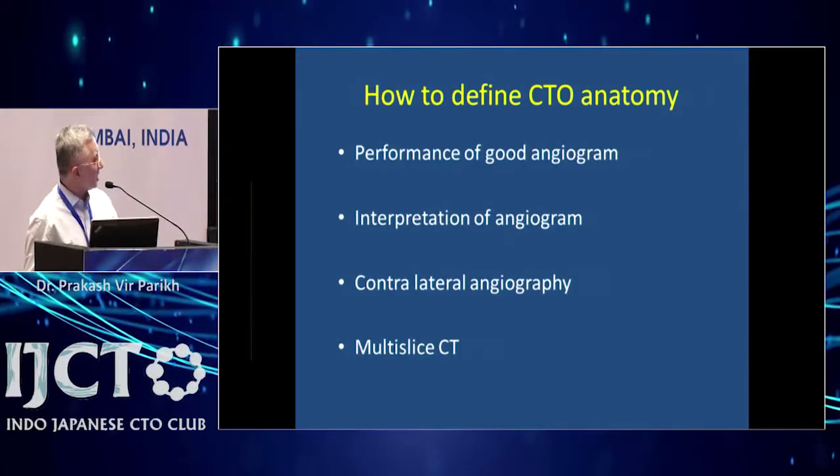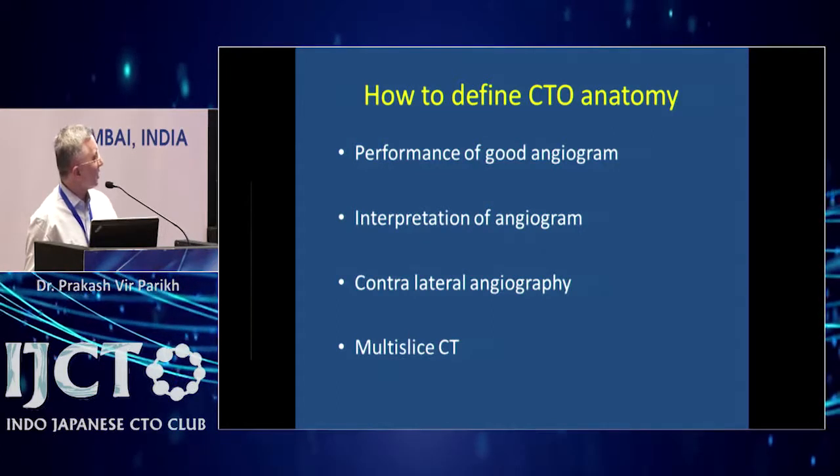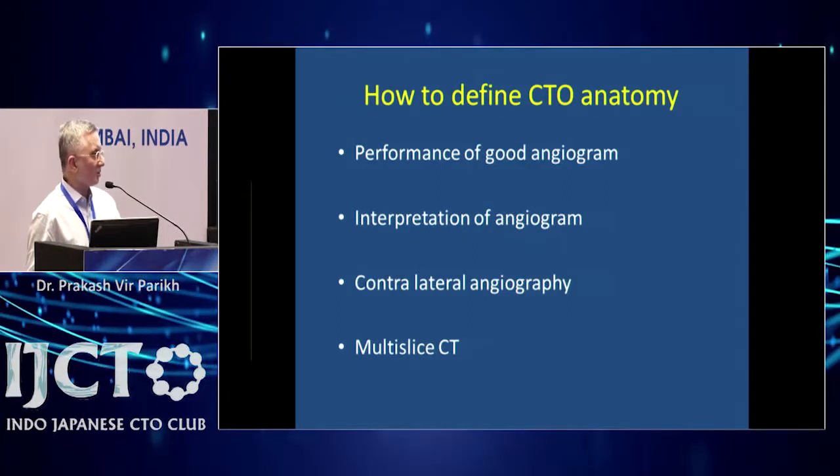This has been discussed already previously in detail, so I will not go into details. But it's very important to define CTO anatomy before you start the procedure. If you do not correctly understand the CTO anatomy, then you will probably fail the procedure very easily.